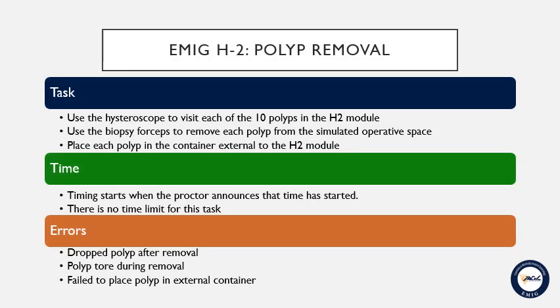The objective of the task is to visit each of the 10 polyps in the H2 module with your hysteroscope. As you visit each of the targets, use the biopsy forceps to grasp and remove the polyp. While leaving the polyp and the jaws of the grasper extended from the distal end of the hysteroscope, withdraw the hysteroscope from the simulator, and then place the polyp into the external collection cup. Time begins when the proctor announces that they've started the timer.